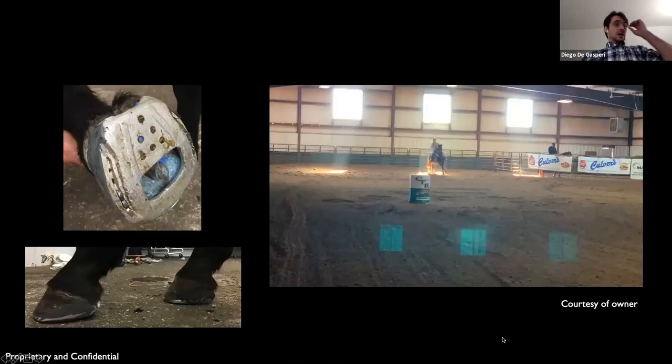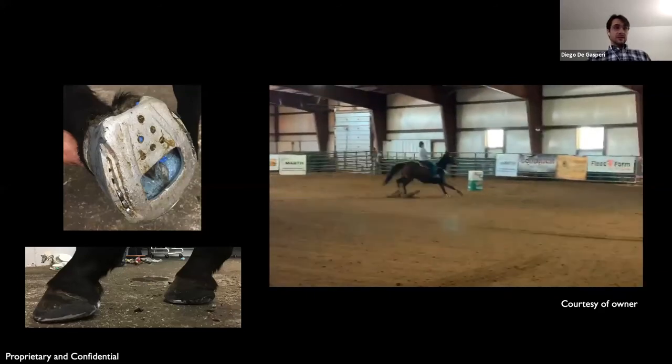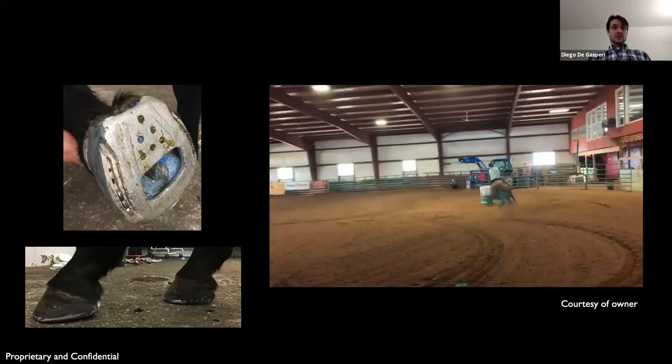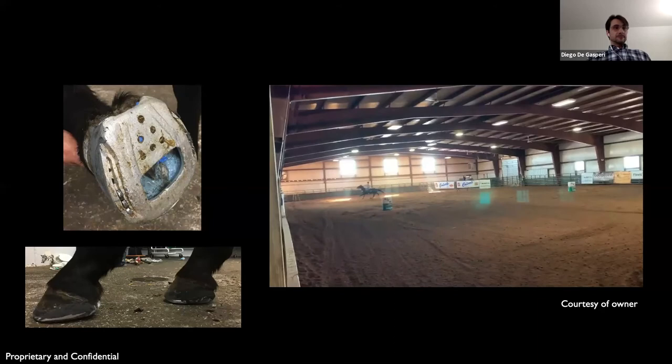This horse, we placed the rocker rail shoes with that bar on the palmar aspect to protect against concussion. And this horse is treated only with OSFOS, a short cycle of bute, and he was transitioned to firocoxib and shoeing. We did not inject any joint or bursa. And this horse, a few weeks later, won a race, a local race. The client was very satisfied, came back for reshoeing, and the horse was basically sound before the second shoeing cycle here with us.